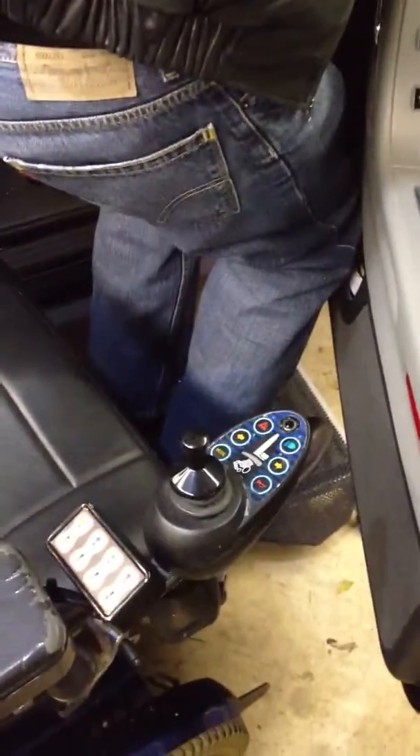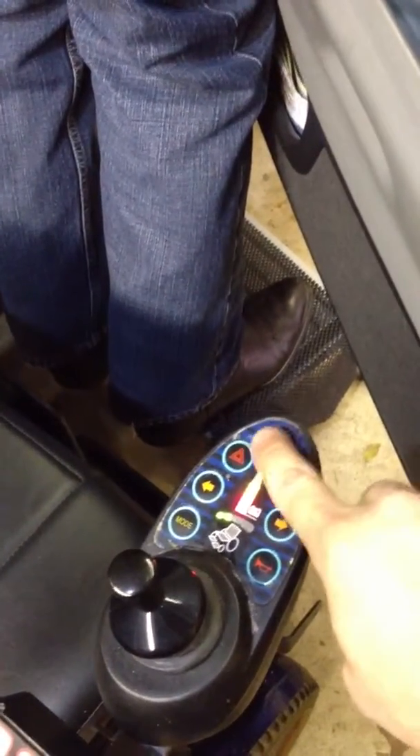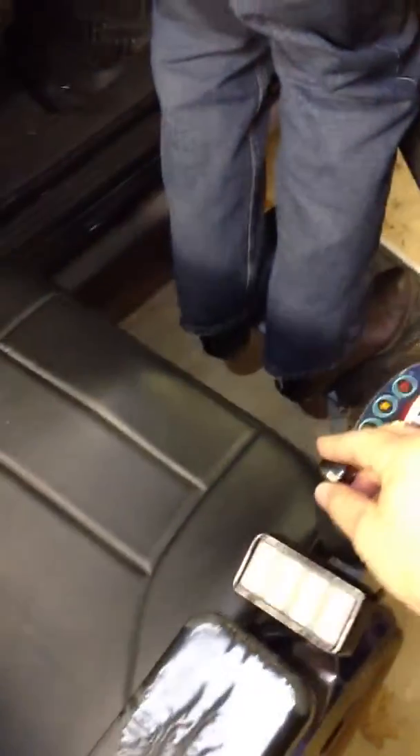And as he pulls up and stands up, then the driver's next job is to turn the wheelchair back on and move it out of the way. So while he's standing on the stool, we will turn the wheelchair on by pushing the power button on the top here. The wheelchair he uses may look a little different from this one, but the power button will be in the same place. Turn it on, and then back the chair up out of the way.